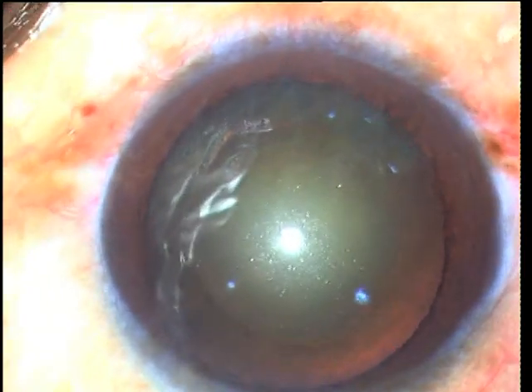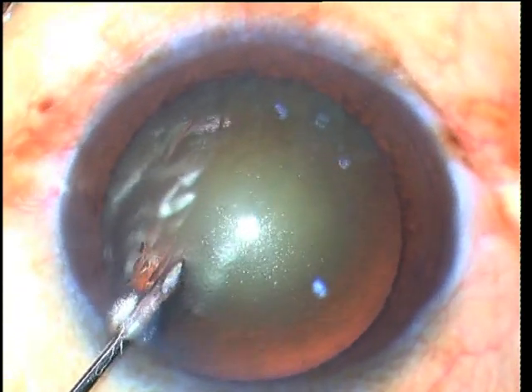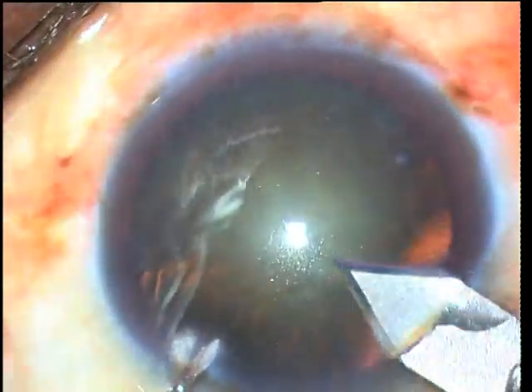As you can see, the main port and the side port are kept at an angle of about 60-70 degrees to each other, and this is to facilitate cracking in an easy manner later in the surgery.